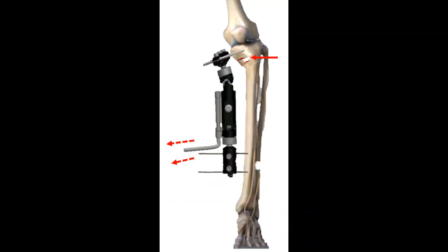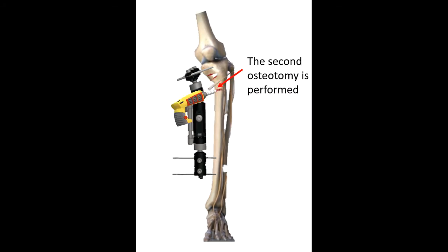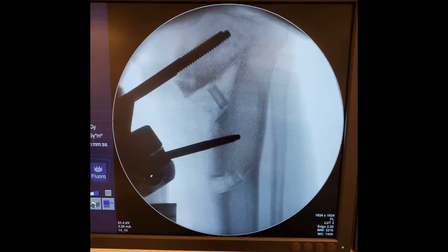Then the fibular bone graft is introduced. After this step, we place the accessory pin in the anterior plane, distal to the first osteotomy, and 3 cm distal to it. We perform the second osteotomy from medial to lateral, keeping the lateral cortex integral.